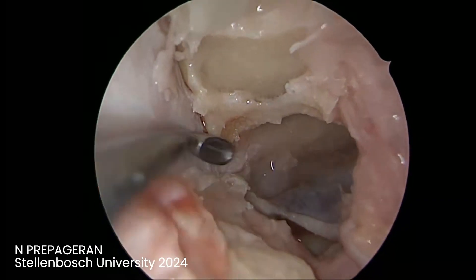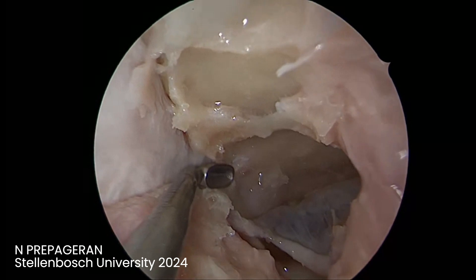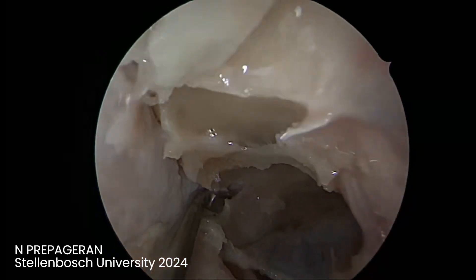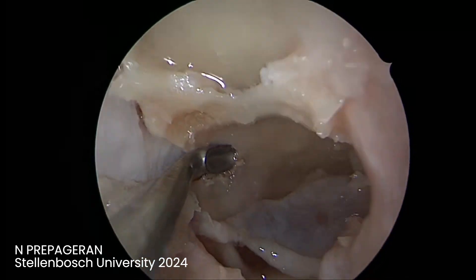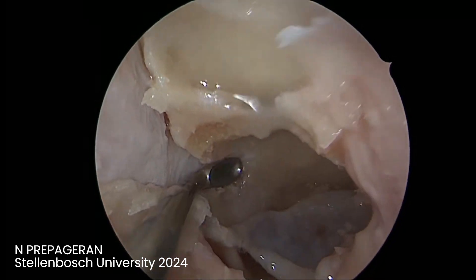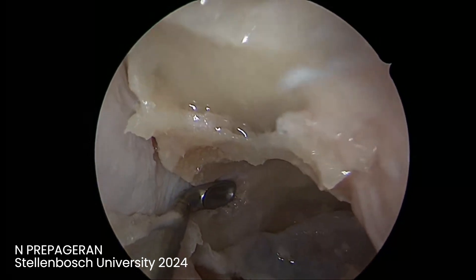I'm just going to do this — remove the bone, stretch. Usually this bone comes out easily. Can you see how much force I need to use? You remove the bone until you come to the opticocarotid recess.